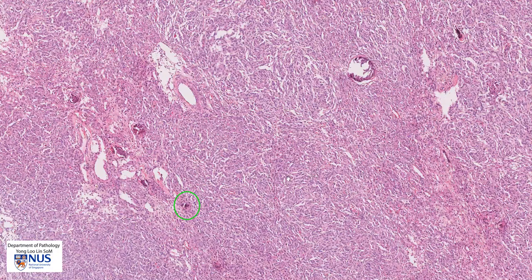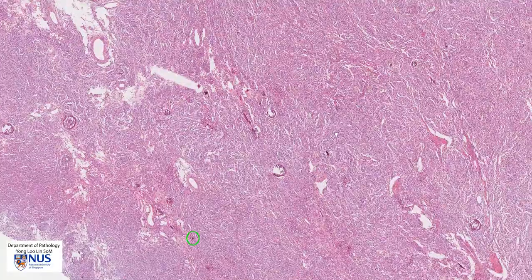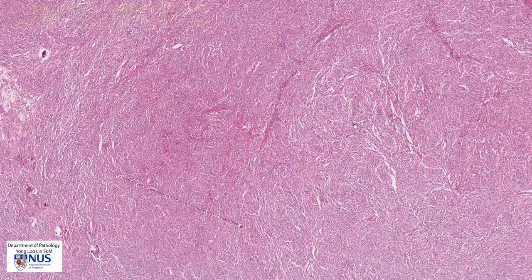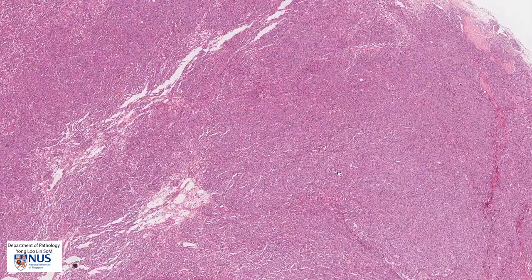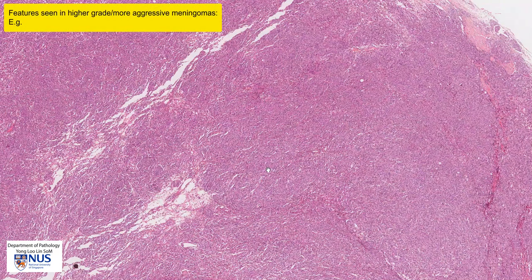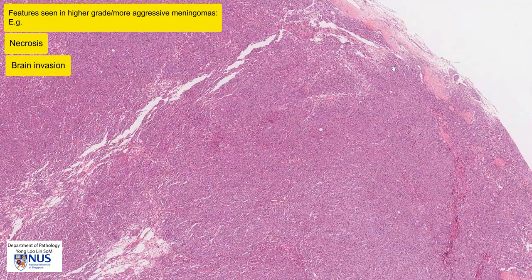This is an example of a meningothelial meningioma. This particular tumor is usually a low-grade tumor, and we use the World Health Organization WHO grading system — it's usually grade 1. There are some features that would make us worry about a higher grade, and these always have to be looked for in meningiomas, including things like the presence of tumor necrosis, invasion into the brain if there is any brain tissue also excised, and the presence of increased mitotic figures.